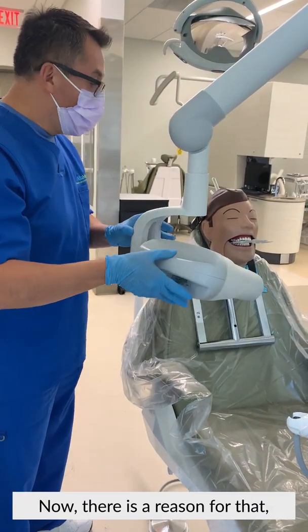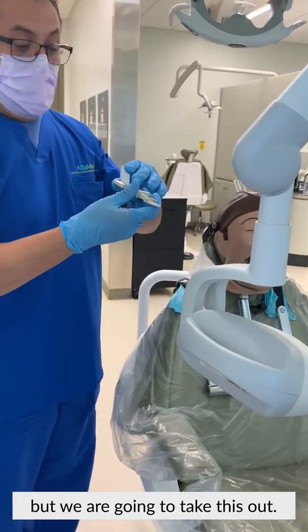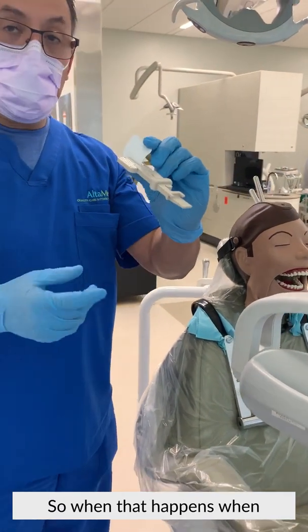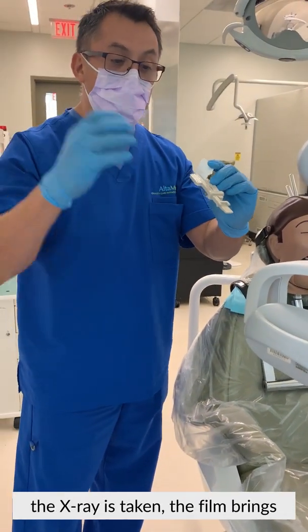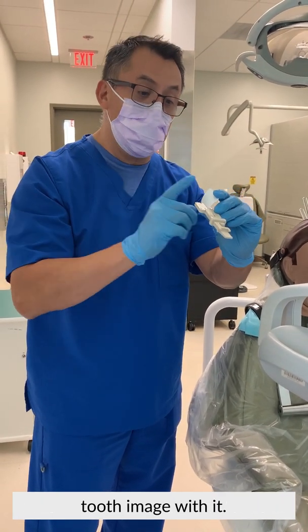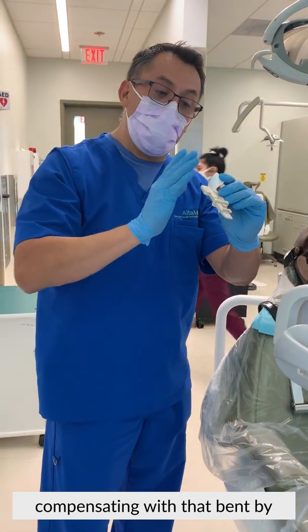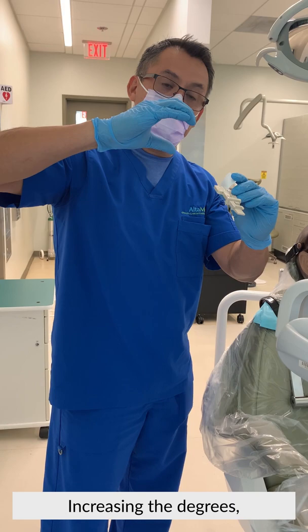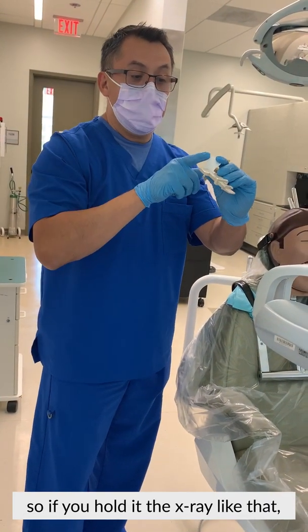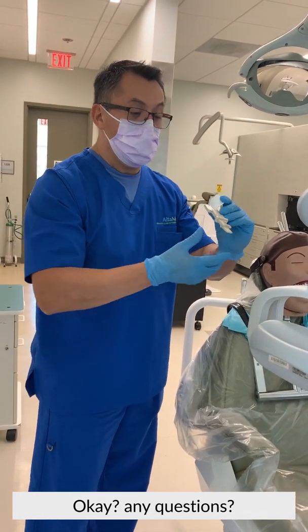Now there is a reasoning for that, so let me explain that real quick. I'm gonna take this out. If you notice the film already falling back a little bit, so when that happens, when the x-ray is taken, the film brings the x-ray image or the tooth image with it. So what you have to do, you're compensating with that bend by creating the degree. So it's gonna accommodate this. If you hold a PID straight like that, this is going to create an elongation, and that's an error you don't want. Okay? Any question?